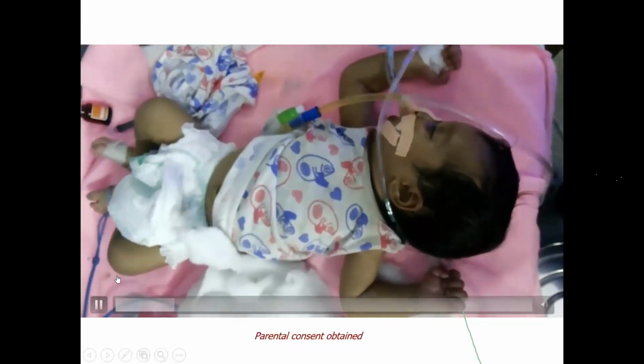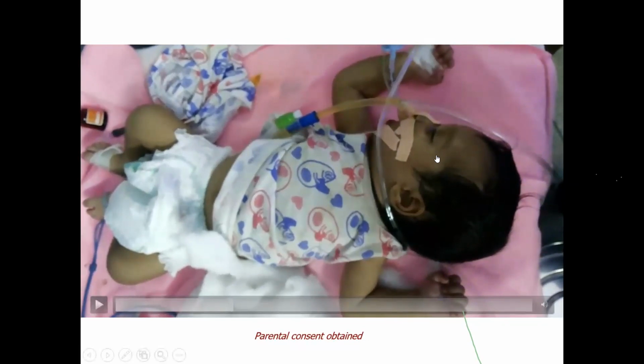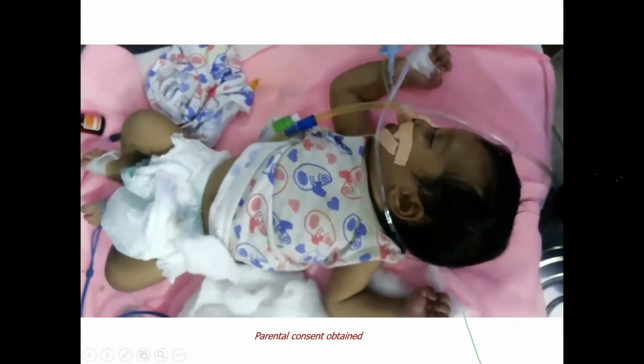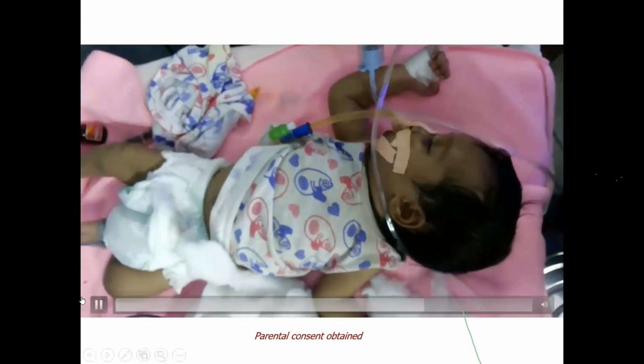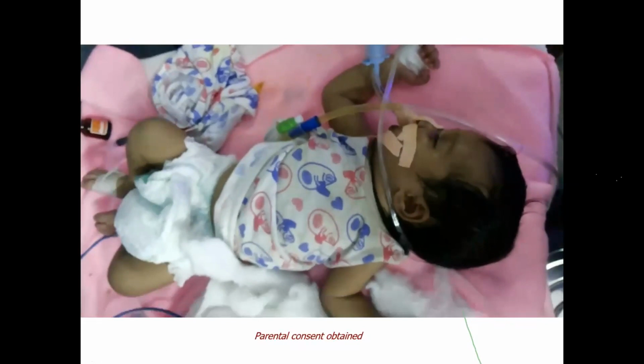This is a video of a baby who, here, you see a sort of jitteriness, but it's actually not jitteriness. There are small brief myoclonic activity involving the lower limbs and upper limbs, with no stereotype, with no regular fashion. In fact, it is more like a myoclonus.